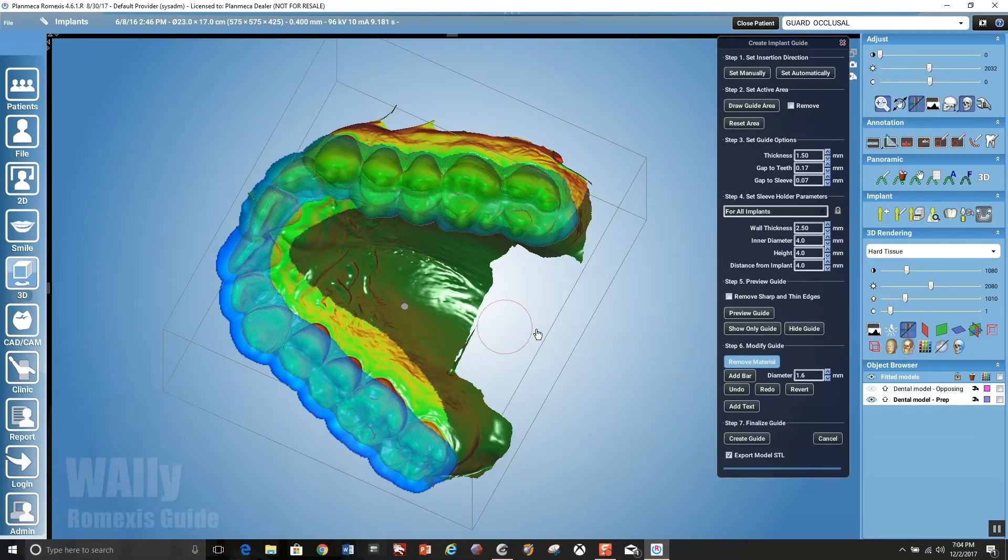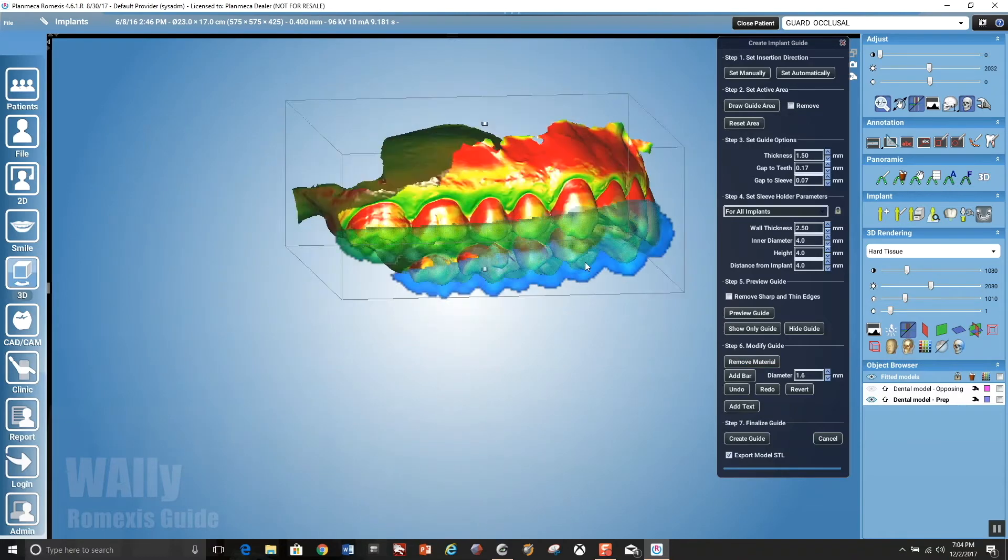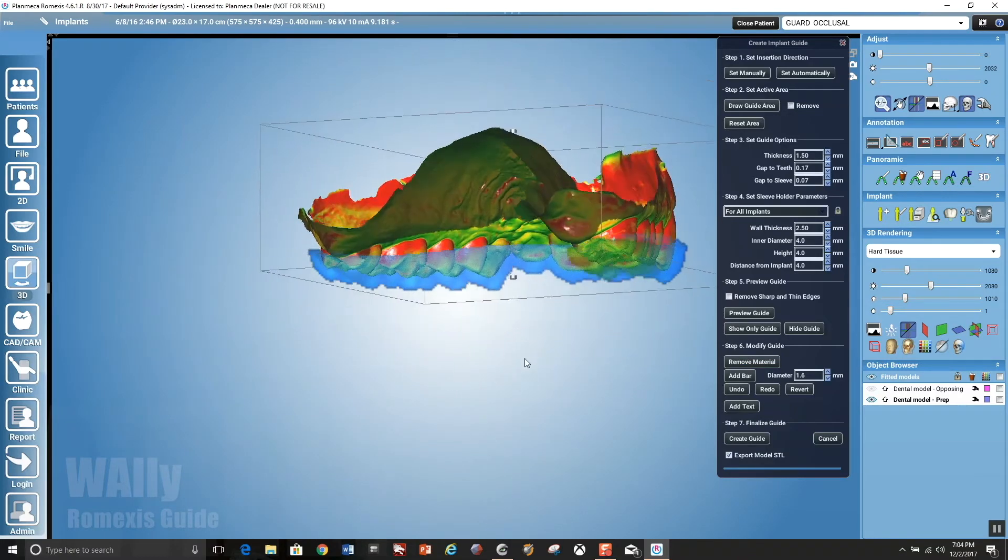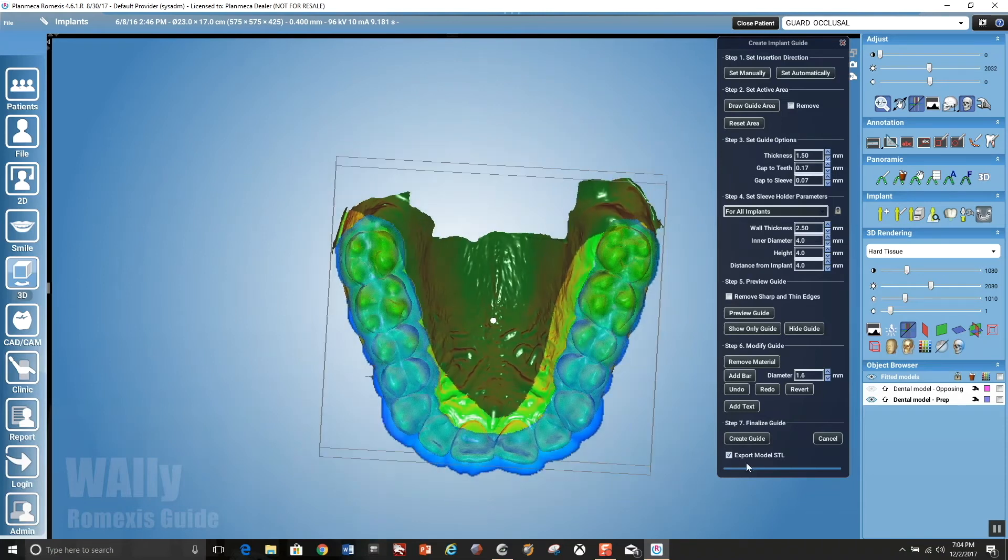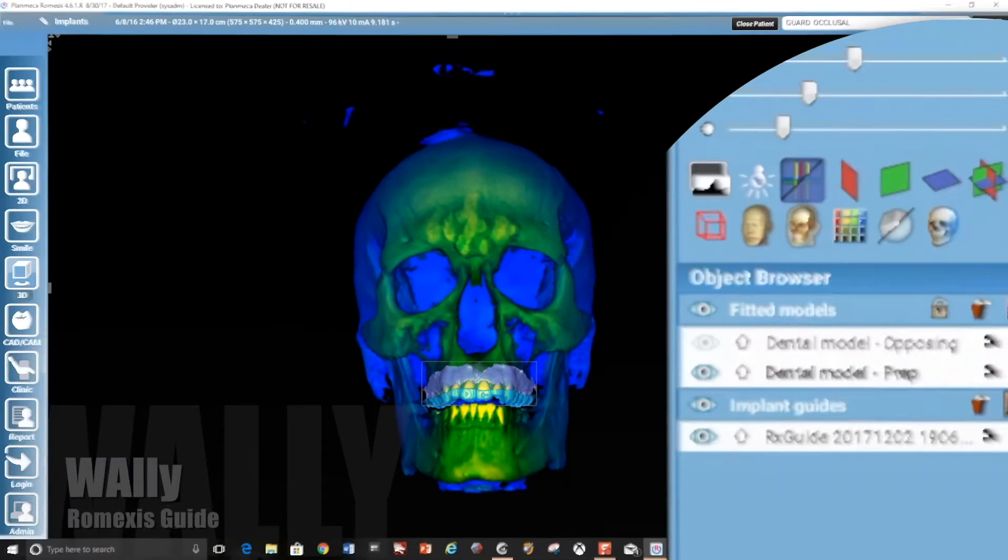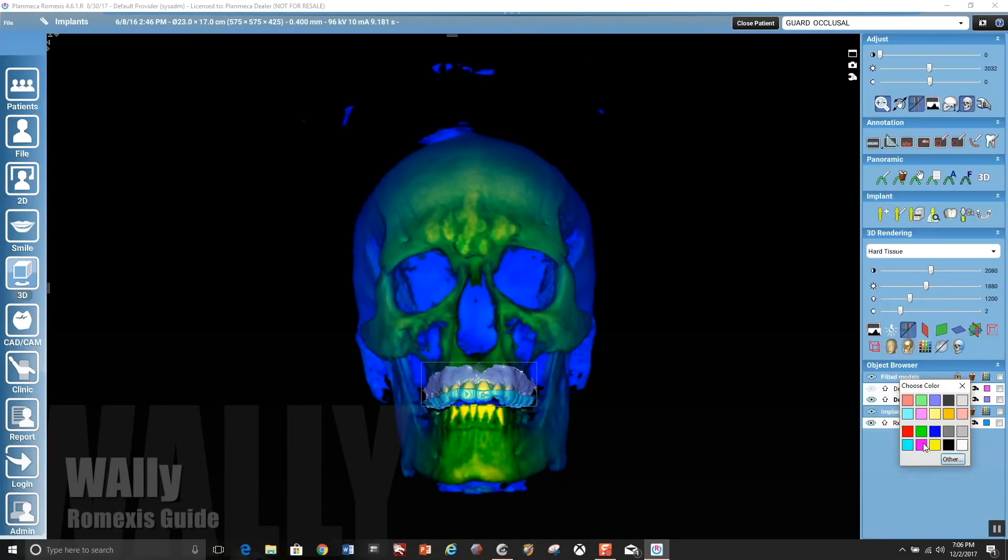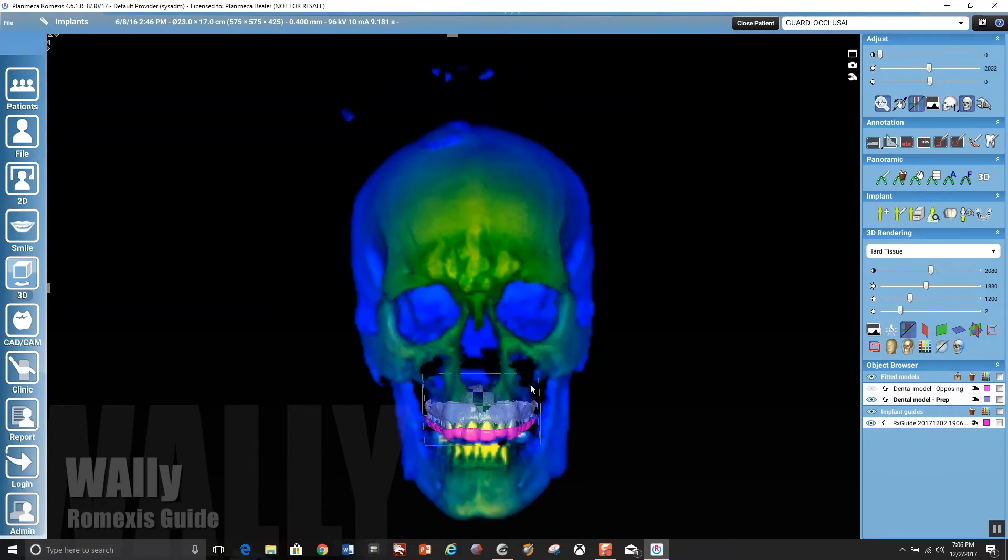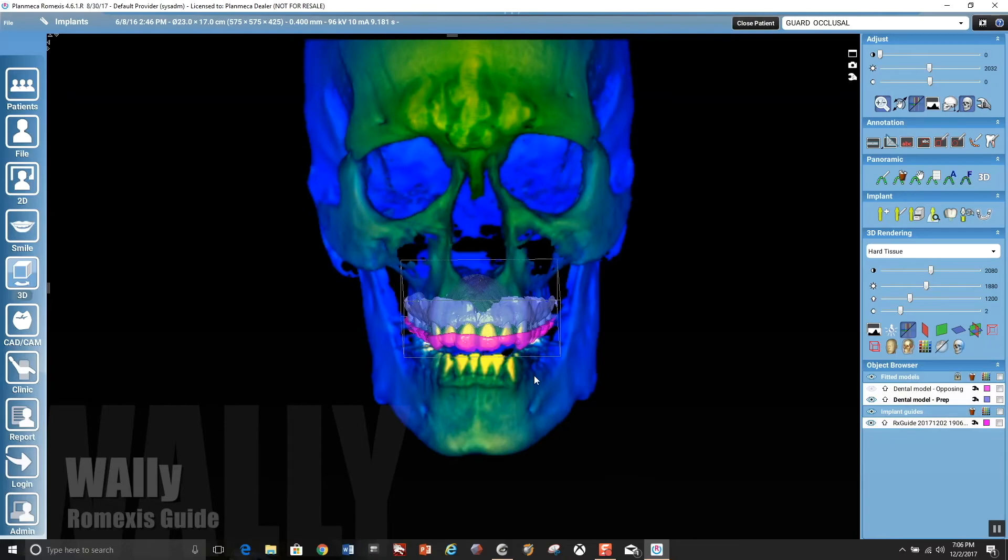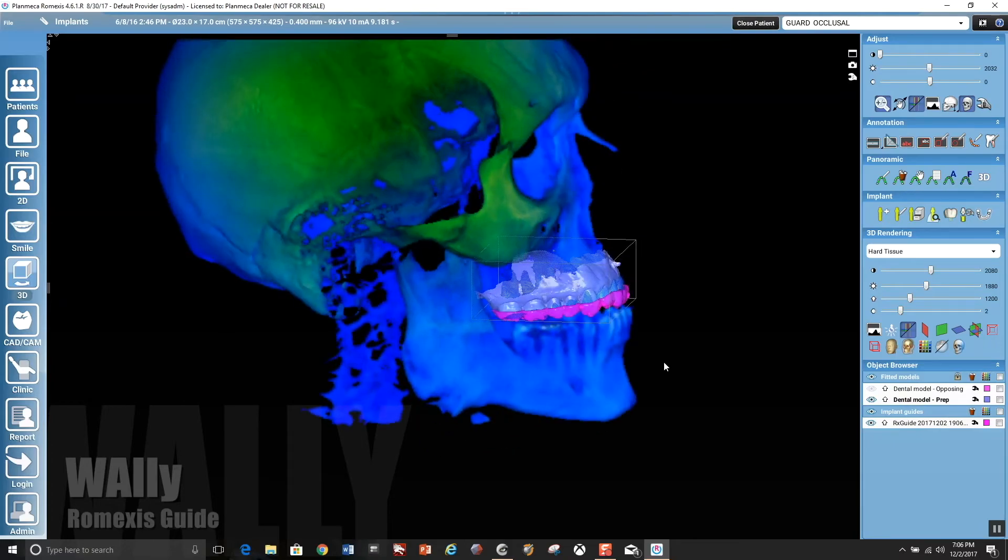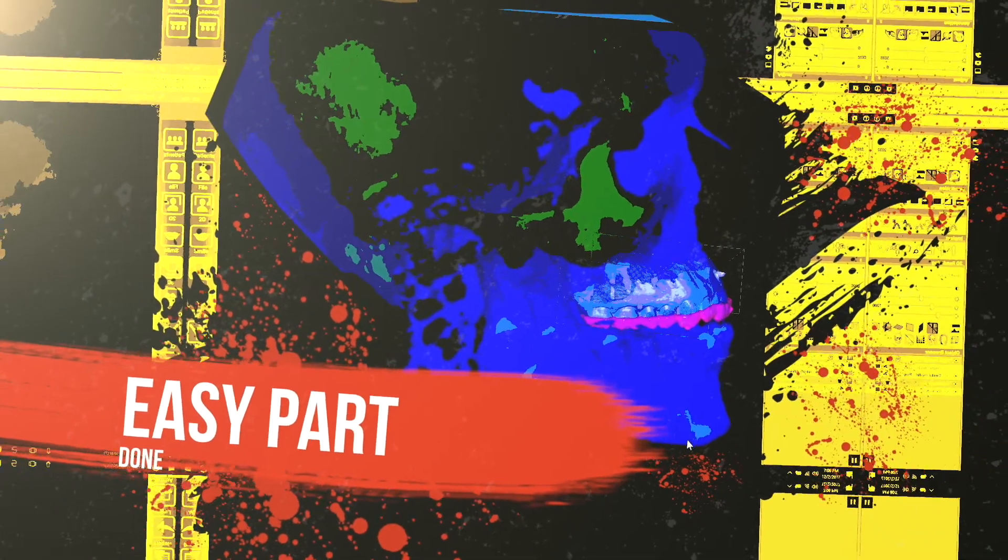We're going to export this now. So you're going to go down to the create guide button on the bottom right there of the module. You could add text if you want, but in this instance, we didn't need to. And it's going to reimport that back onto the DICOM data. I'm going to make it plain mecha pink here. If that's not hot, I don't know what's hot. That's awesome. So the easy part's over.